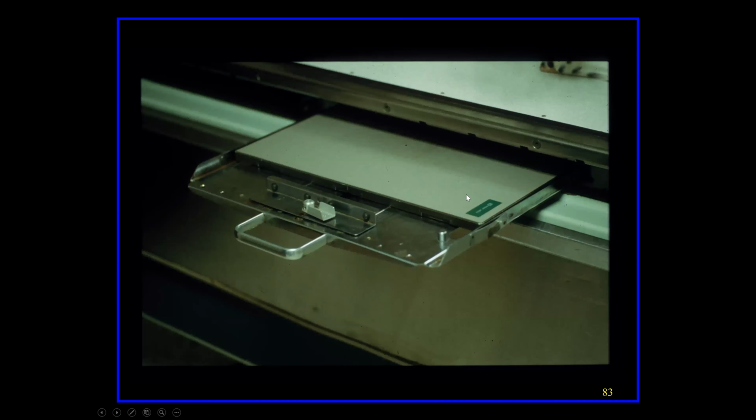This tray, back in the old days, was a cassette, and this is called a Bucky tray. You would pull it out, and there are still some clinics that use film cassettes, and there's nothing wrong with that. You would pull this tray out, stick the cassette in, and stick it back in underneath the tabletop. If you have digital X-ray, which most people do now, they will have a DR flat panel for the most part. The DR flat panel is basically the same size as this cassette. You put it in the Bucky tray, stick it in under the table, and leave it. You never take it out. It just sits there all the time.